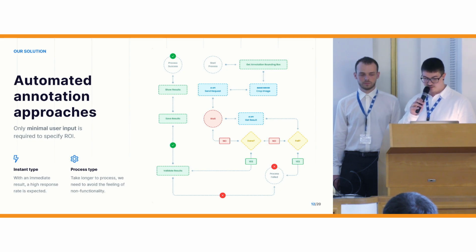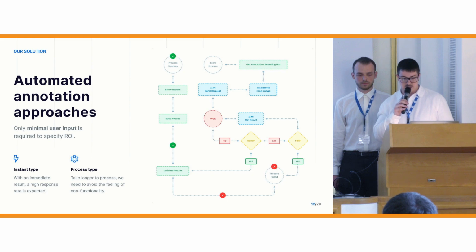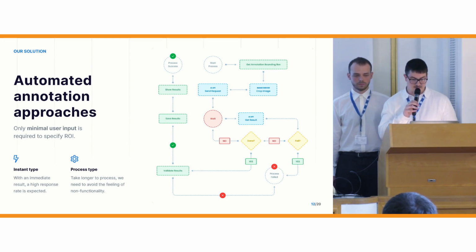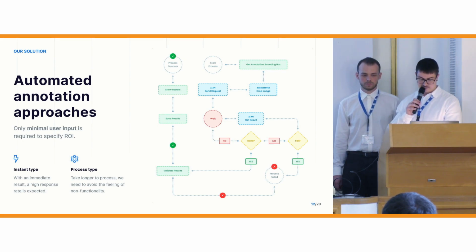This diagram shows the sequence of process steps where the cutout area along with the user input needs to be sent to the AI API for processing. The status and the result of operations are then polled at specified time interval.